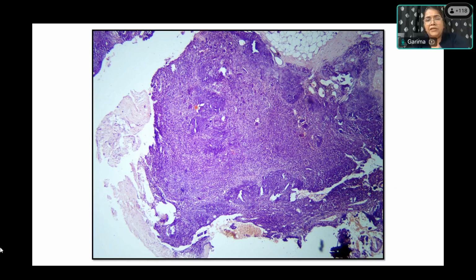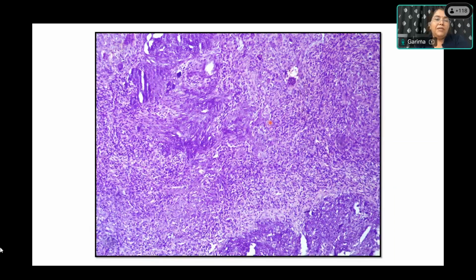At this part, maybe you are seeing a bluish kind of tumor. You are seeing some giant cells kind of structures. Yes, ma'am. You are seeing some giant cells. Let's move on to the next power. Now here, what are these things? What is this you are observing? This, ma'am, this is a giant cell, ma'am. This is a giant cell, right?